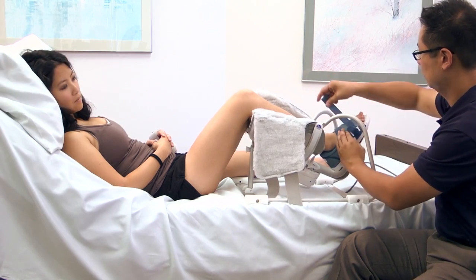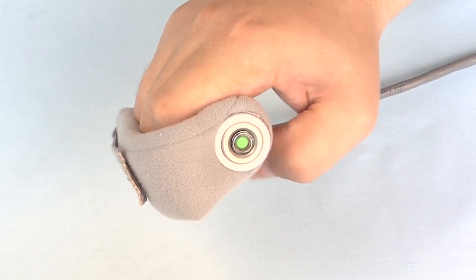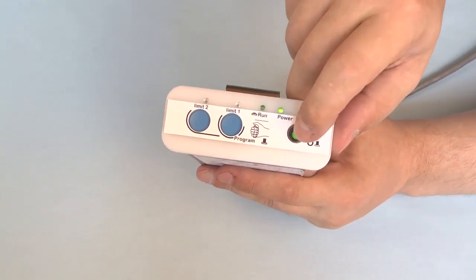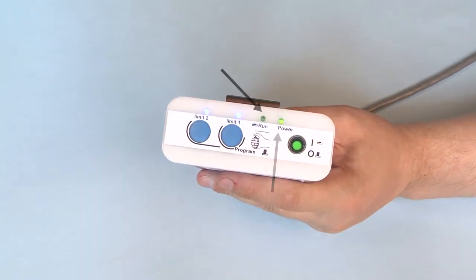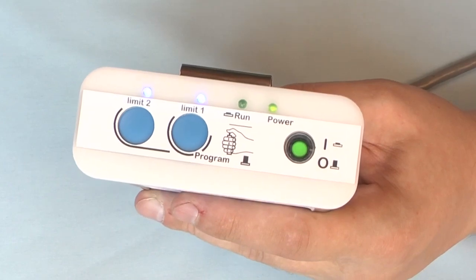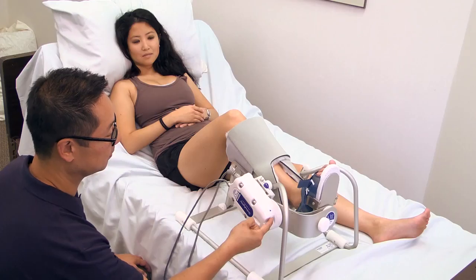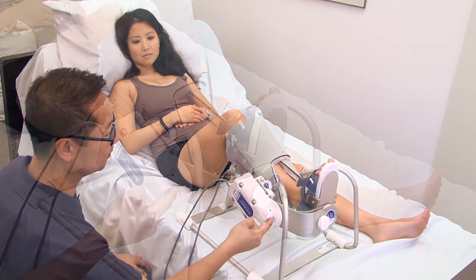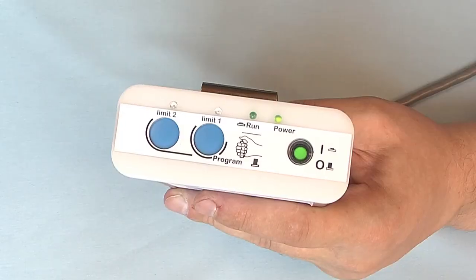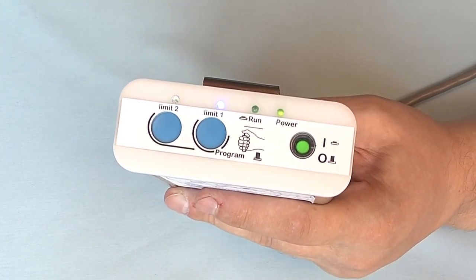We're now ready to program the range of motion with the programmable motion controller. First, turn the patient on-off button off and the controller on. Note the power indicator light is on, but the run light is out. The flashing blue limit light indicates the controller is ready to receive programming. With the forward button, run the actuator to the first range of motion limit.